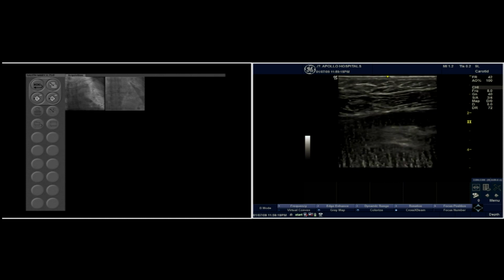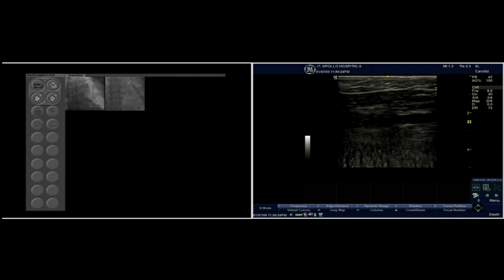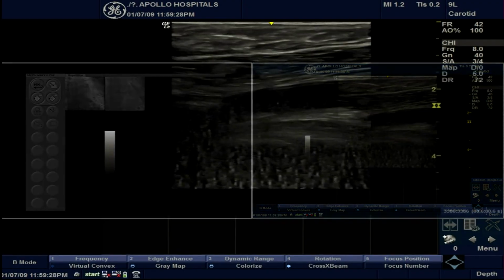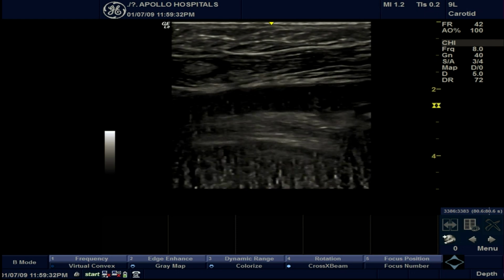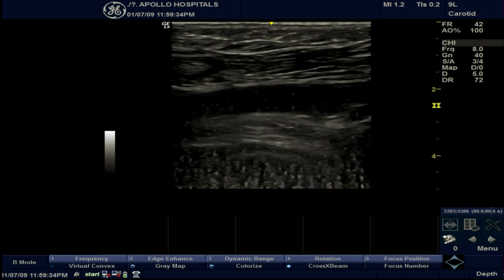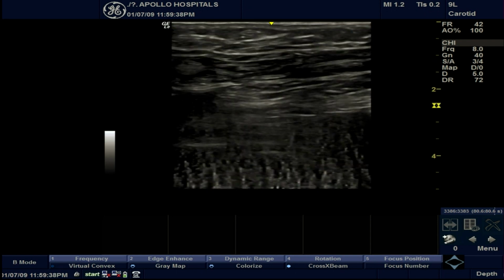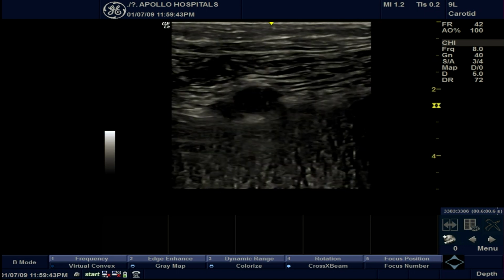We were used to using fluoroscopy, but now we have moved to ultrasound. So we can see the bifurcation down here, and then we move more above, and you can see the femoral head very clearly there. So this is where we want to puncture. We can puncture with this, or we can go more to short axis. We prefer to go to short axis, and you can see the artery. So we just have to puncture.